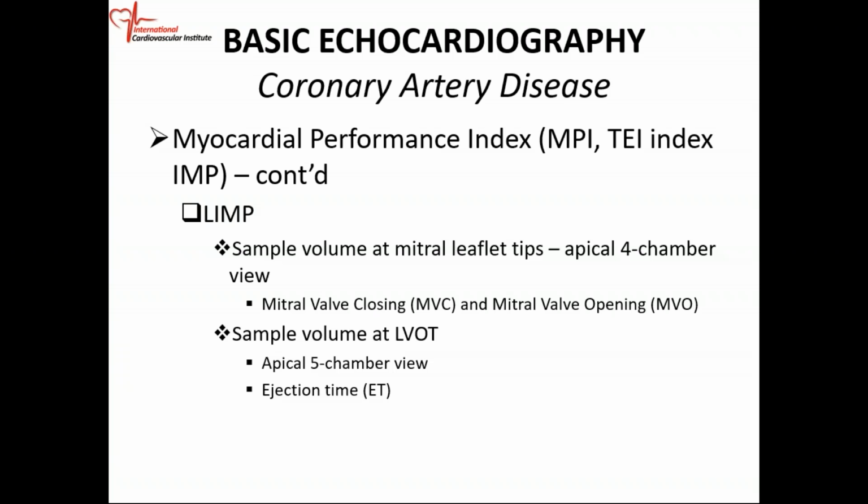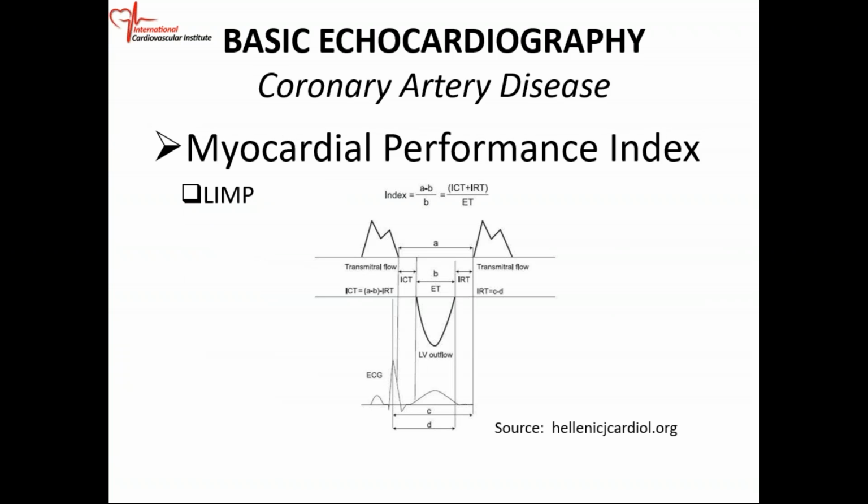You need to get your mitral inflow, and remember, when you're doing your mitral inflow, it is at the mitral valve leaflet tips in the 4-chamber view, because we talk about mitral valve closure to mitral valve opening, and we remember now we're talking about pulsed wave Doppler. So 4-chamber view, the sample volume is at the mitral leaflet tips. And then in order to get the ejection, you have to do your 5-chamber view, is the ejection period or ejection time. All right, so this is what you should be visualizing.